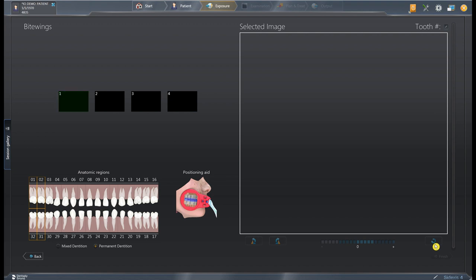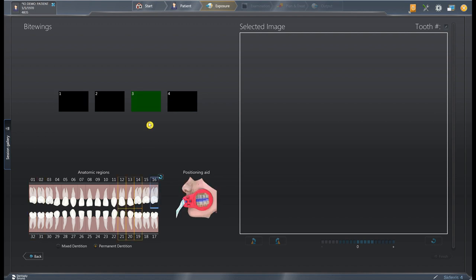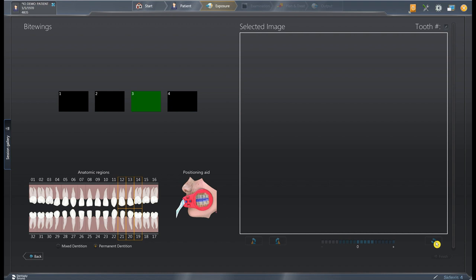The button in the bottom right-hand corner — a half arrow — will allow you to recapture an image. So let's say we were on template number three and we took an image we didn't like: we would highlight it, hit that button, it'll bring up a side-by-side screen, you reshoot the image, and then select which one you prefer to be put into the template as we move into the light box.